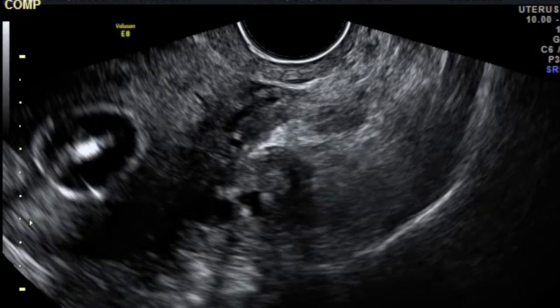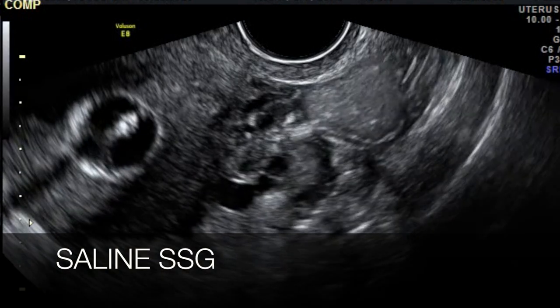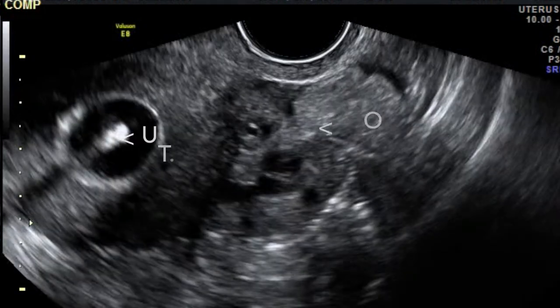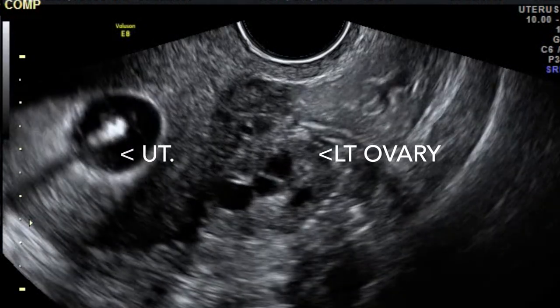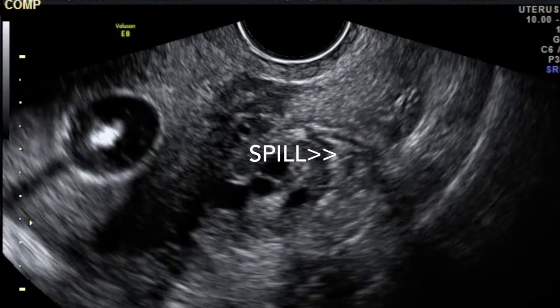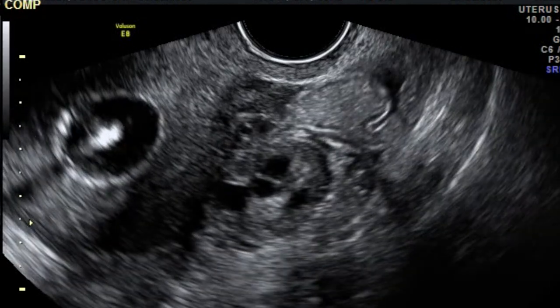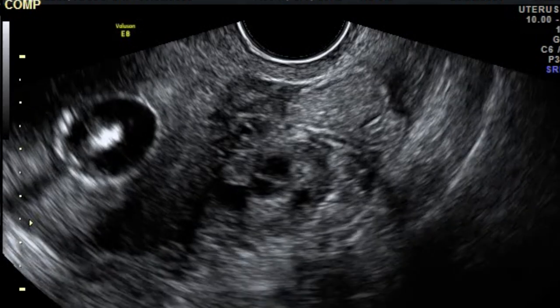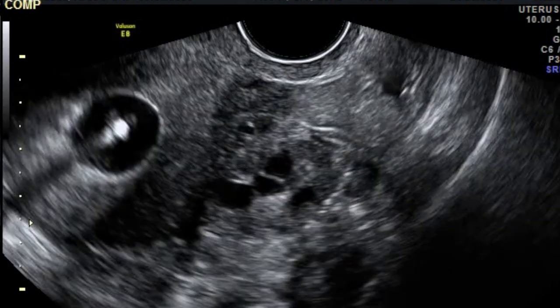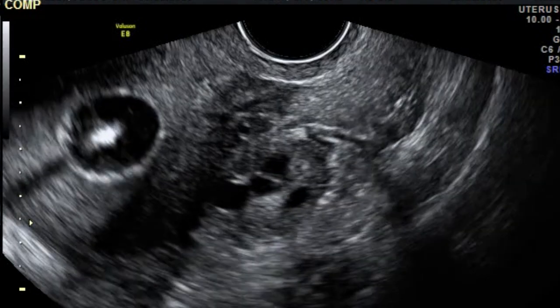This is an example of sonosalpingography using saline, just for comparison. The saline is injected into the endometrial cavity and immediate spill is seen, with some collection also visible in the pouch of Douglas. We can comment about the patency of the fallopian tube, but we cannot see or delineate the fallopian tubes themselves.